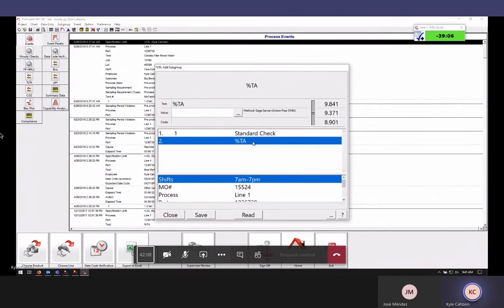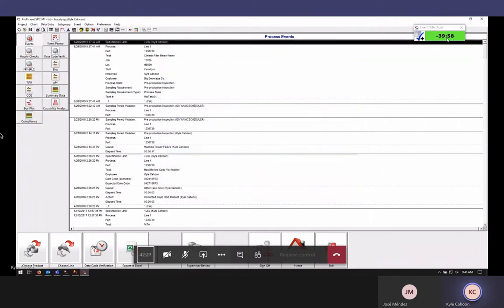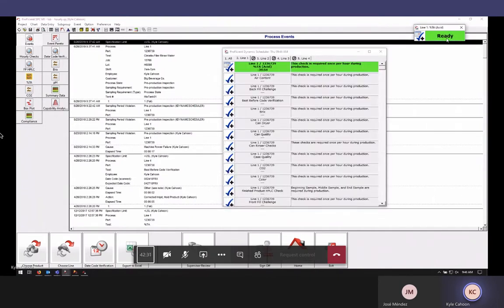So here we need to enter our TA, which is the name of this test. So you'll notice here I have 38 minutes and 50 seconds. As soon as I save this, my timer resets back to 40 minutes when the next check is due.